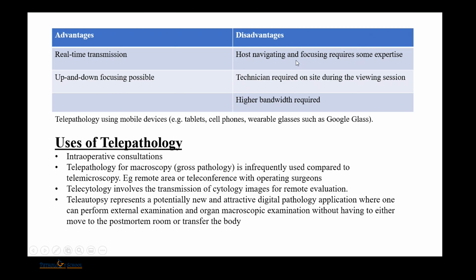Disadvantages are that a technician or someone is required, higher bandwidth is required, and navigating and focusing requires some expertise. Now, uses: this can be used in intraoperative consultations. Telepathology can also be used for macroscopy, especially gross pathology in remote areas where there are no pathologists. So you can send images of your grossing while grossing is being done, or teleconference with the operating surgeon.